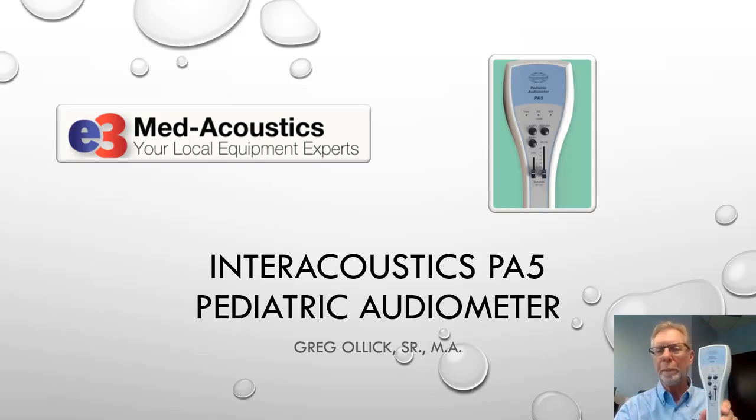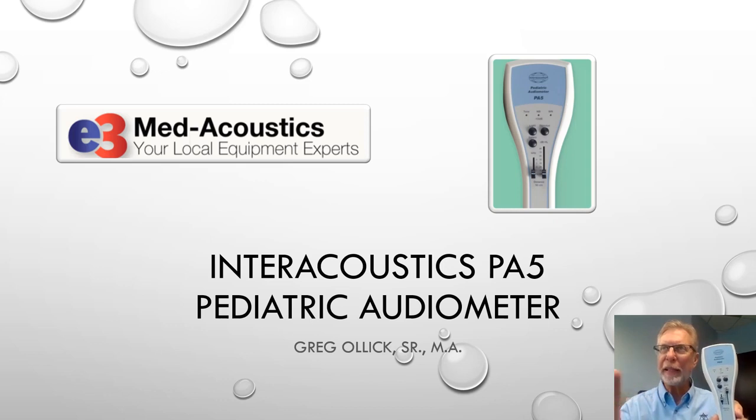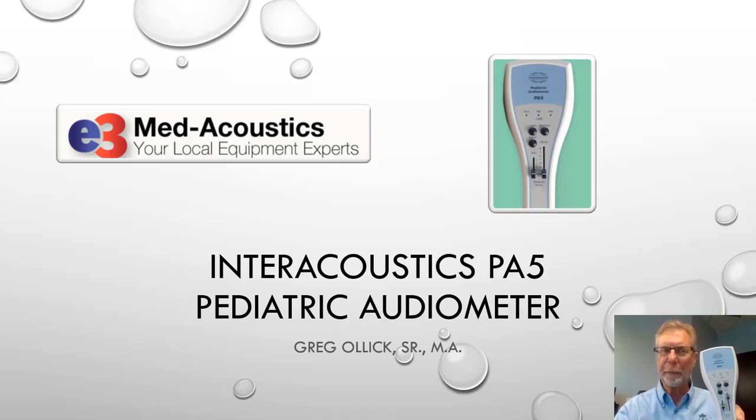So I'm going to go over basic operation, and then we'll talk about how we would test different types of pediatric patients with it.